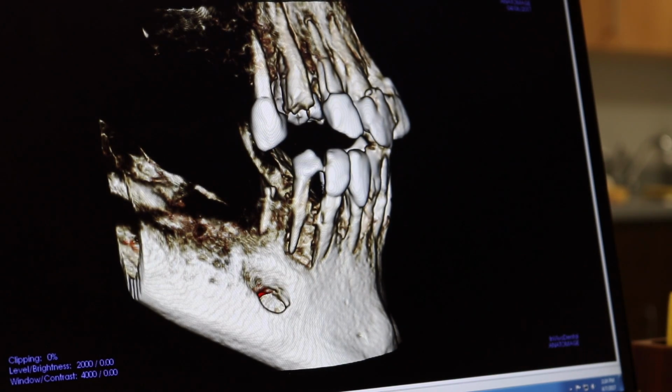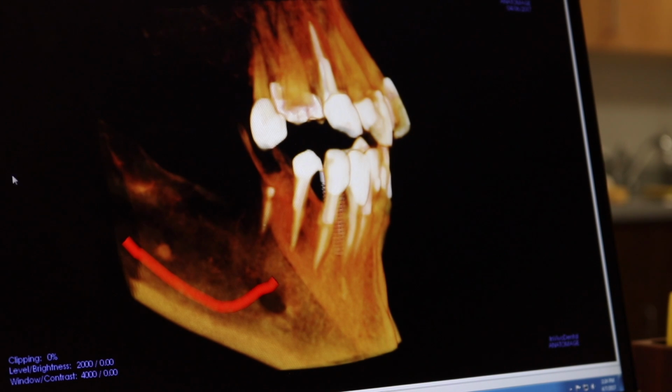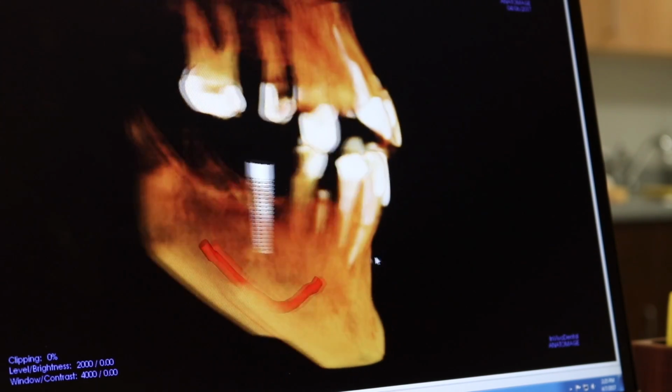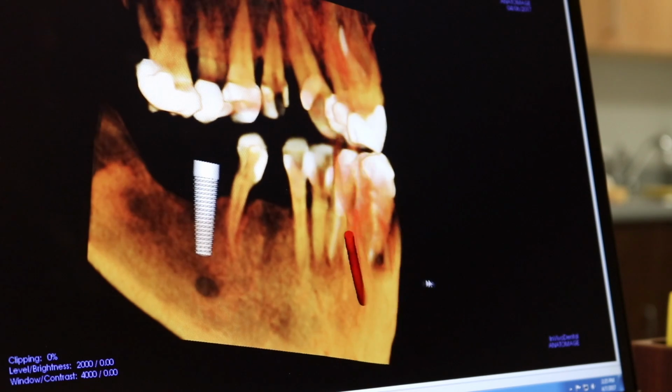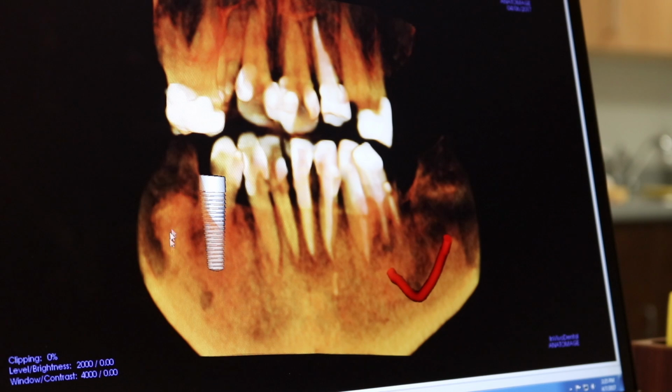So with this, we can look at the bone, see how much bone we have. I can take away the bone, and I can even outline where our nerve is, marked here in red, so that when we place an implant, I know exactly what depth, what length, what measurements to use. I can turn it around so I can see the back side of the nerve running along the jaw. As you can see here, we've already placed an implant on the patient's left side here.